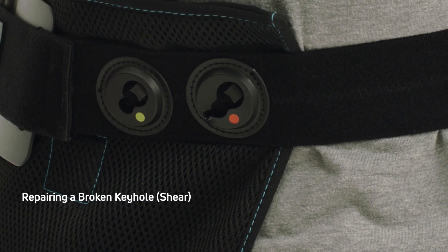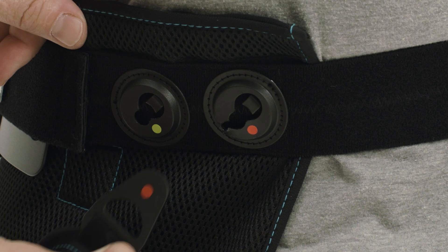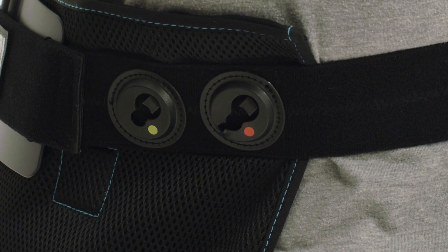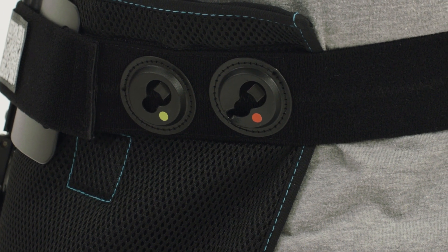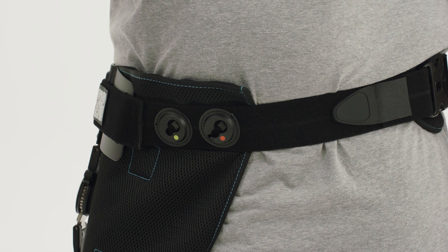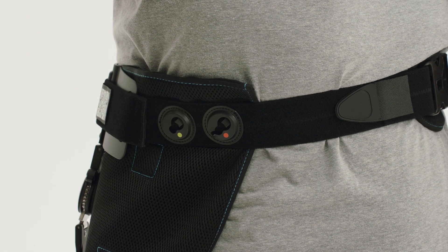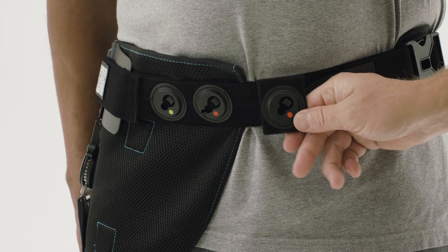If a patient presents with a broken red keyhole, usually one of two things have happened: one, the patient has tightened the strap way too much, or two, the patient tightened the strap while seated and broke the keyhole when they went upright or laid down. If this happens and the patient was fit using the existing red keyhole on the brace, you can replace the red keyhole with the rotation strap keyholes provided in the accessory pack.